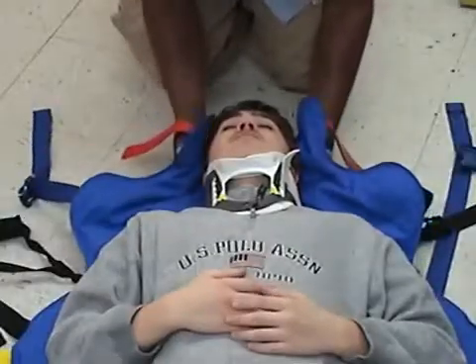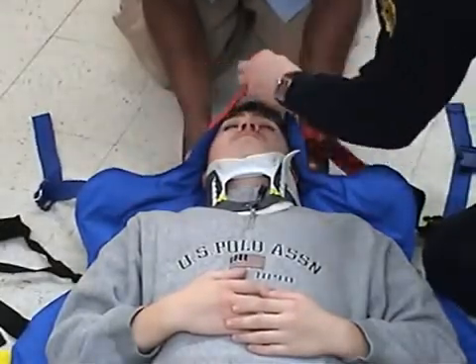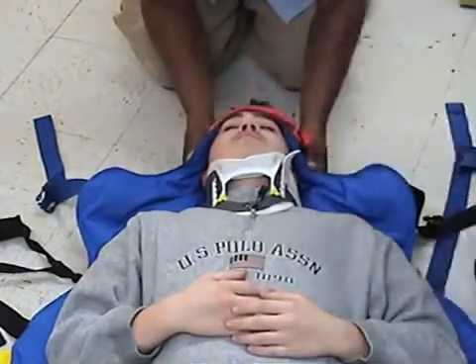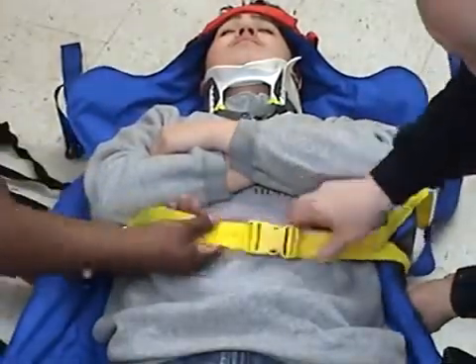Make sure that the red forehead straps are in line with the forehead. See that the patient is not placed too far up — this is a common mistake in first time users. This is a good reason to practice the rescue before an actual call.